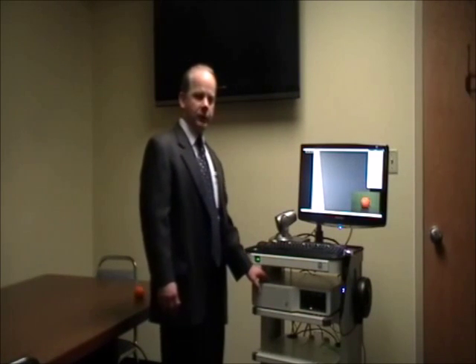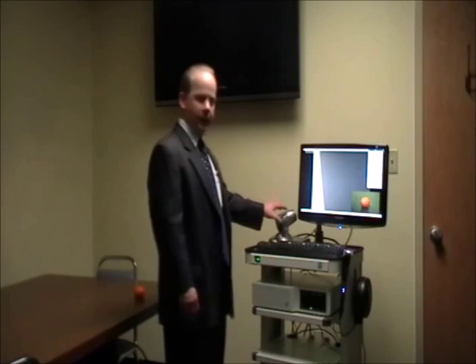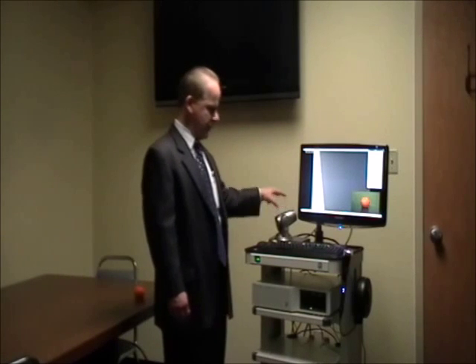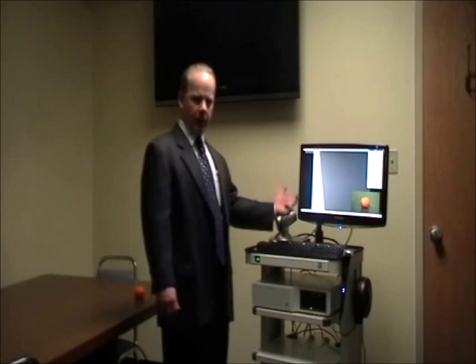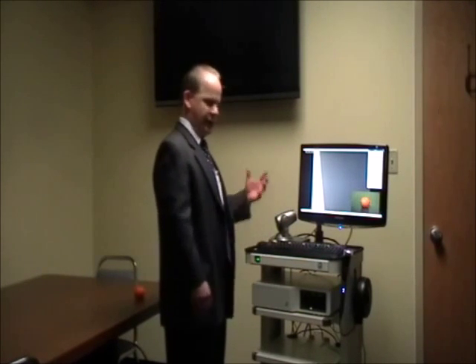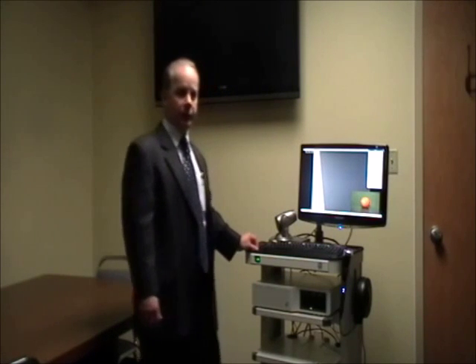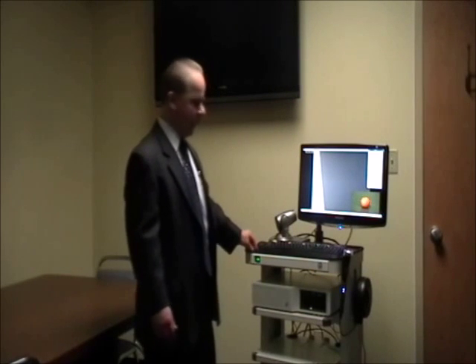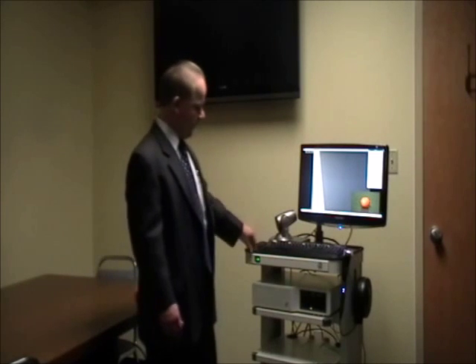We can also set this cart up for two-way video conferencing. This system also supports that. We've got the camera to send our conversational image and obviously the clinical images back and forth. We can also equip the cart with PC speakers as well as a microphone to enable not just two-way audio-video, but also for recording voices if you want to narrate the information, even if you're not doing two-way conferencing, if you want to have a voiceover narration of the case you're working on.